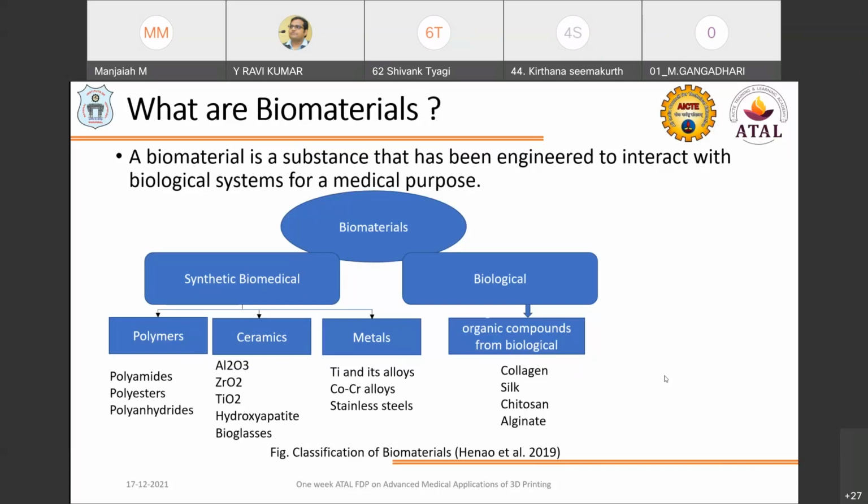And when you come to metal, 3D printing of metal with very controllable structures represents the state of the art of the technology, because wherever we need in the biomedical aspects, porous structures are required. Another thing is that very patient-specific customized implants are required. And another aspect is it should be low manufacturing cost, and it should be manufactured in a short fabrication time. That is what is required in the metal aspects that can be met with this 3D printing.